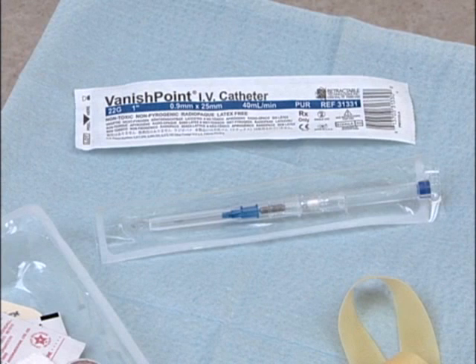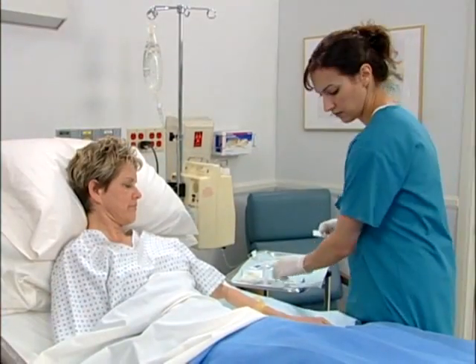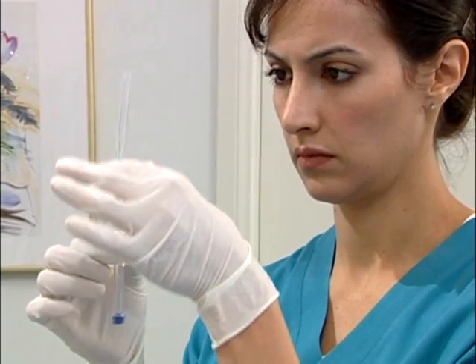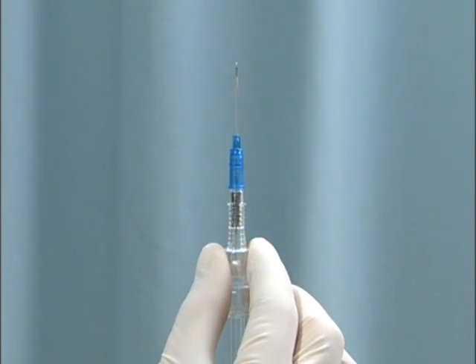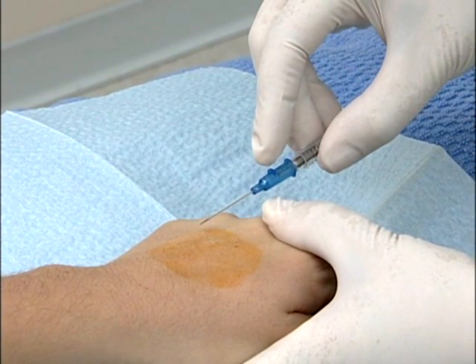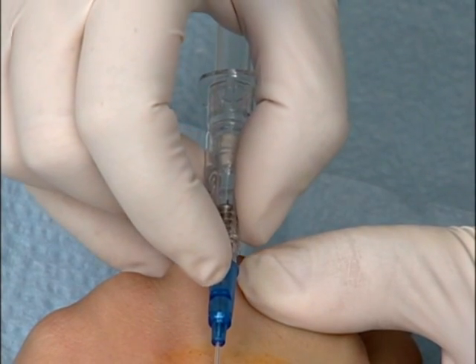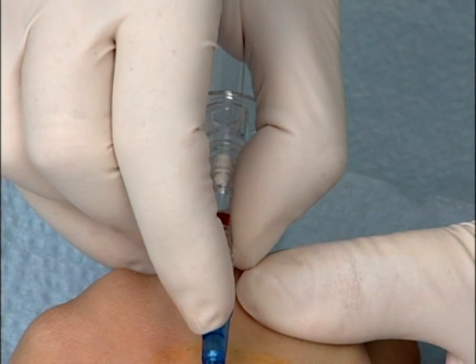Now let's take a step-by-step look at using the Vanishpoint IV catheter. Select and prepare the insertion site with an appropriate antimicrobial agent according to your facility's policy and procedure. Remove the needle cover and inspect the catheter unit. The bevel-up orientation of the introducer needle, as indicated by the push-off tab, allows clear visualization of the flashback chamber. Hold the Vanishpoint IV catheter device with your fingers positioned as shown on the finger grips of the housing, keeping the fingers well behind the needle. Perform the venipuncture and observe for blood return. Then advance the catheter slightly to ensure full catheter entry into the vein.